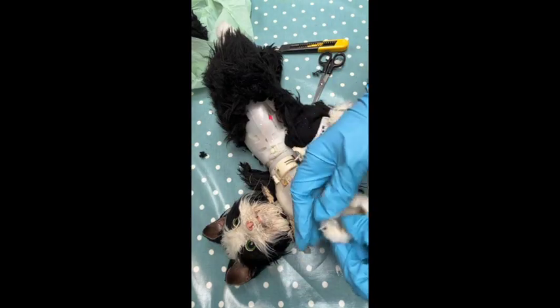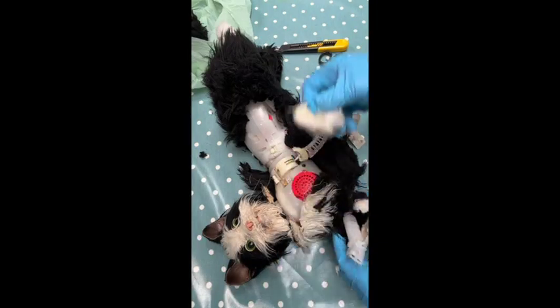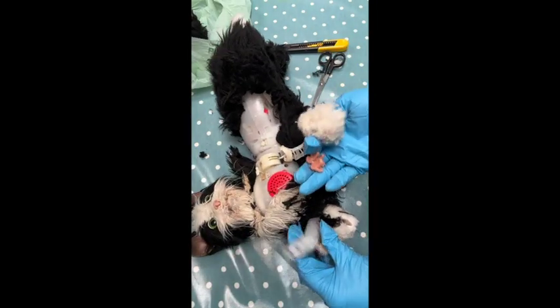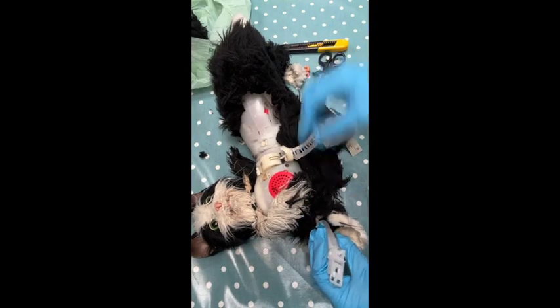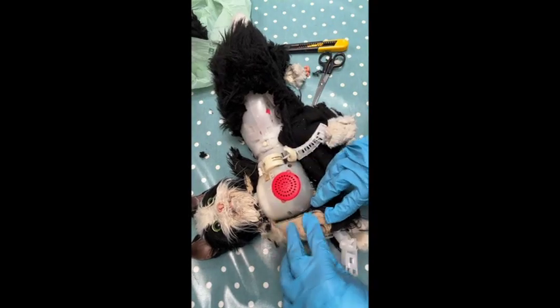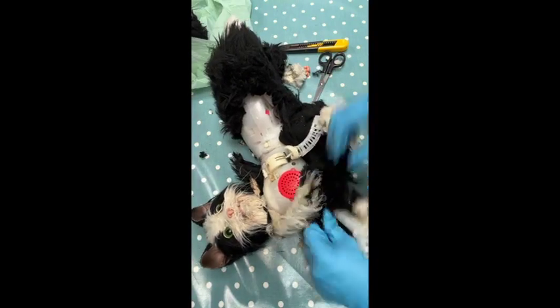And actually that is all that's holding the pad of the foot. The pad is holding the whole foot on there. So actually, if you got the pad off, you could probably get the arm off without too much trouble. Still got that attachment there and attachment there. That's what I found so far.